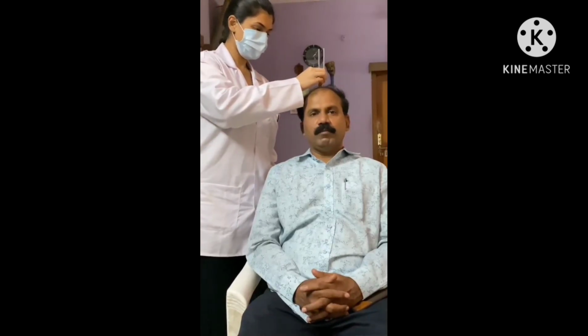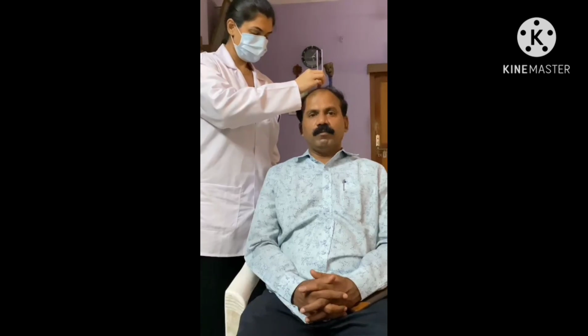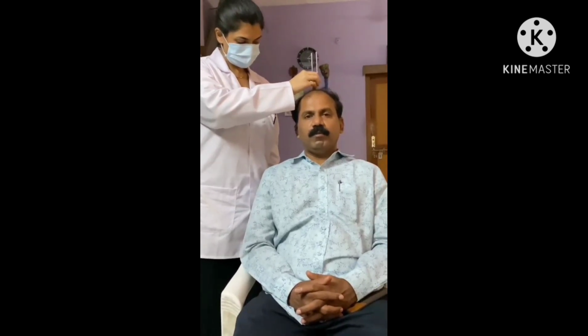Now, test for lateralization by performing the Weber test. Set the fork into light vibration by tapping it on your elbow. Place the base of the vibrating tuning fork firmly on top of the patient's head and ask the patient as follows. Can you hear it in only one ear or both ears? Both ears.